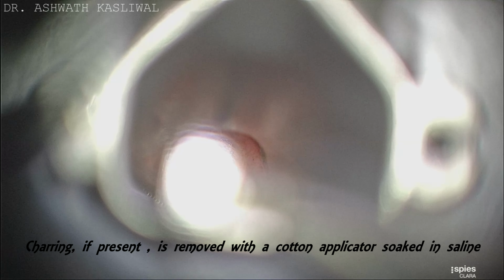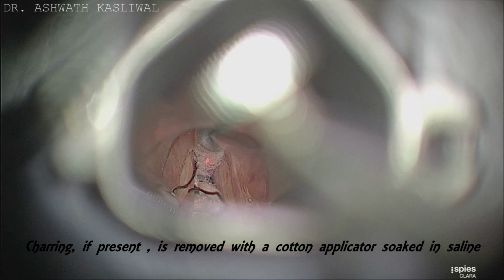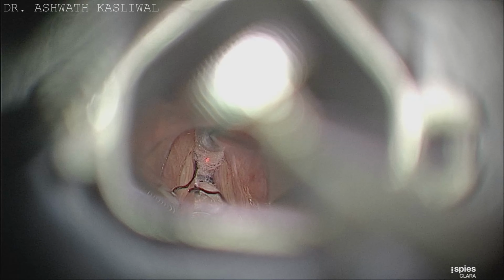If the laser is properly focused, then the charring will be minimum. If charring is present, it is removed with a cotton applicator which is soaked in saline.